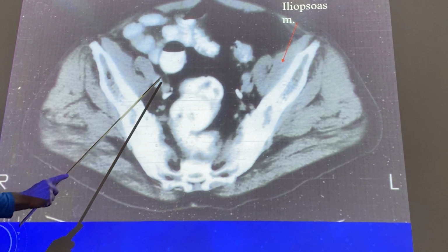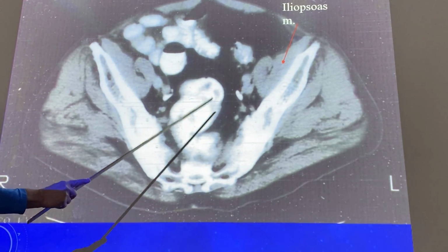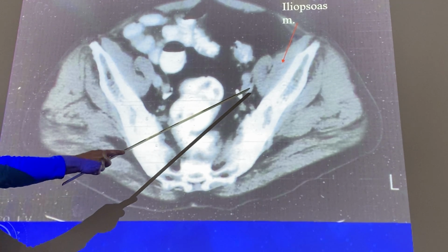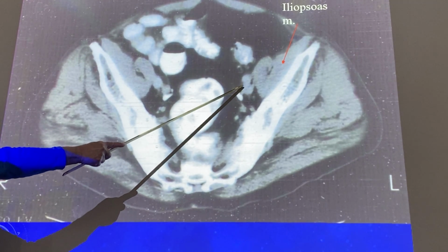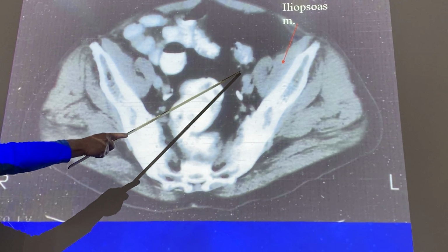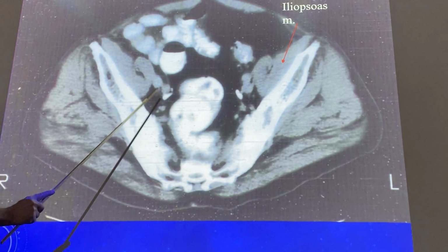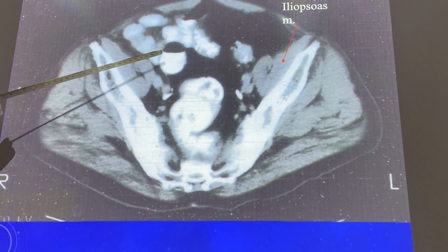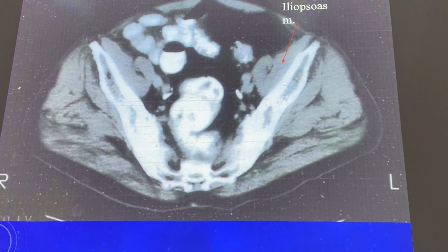Although they're hard to pick up, here's that artifact we talked about. We're in the area below the pelvis, or the sacrum rather, before we hit the femoral head. Although it's artifact, you're going to have the external iliac vein here, external iliac artery, and ureters are coming in right about there, given the fact that we have IV contrast. And we'll get into the GI tract later on.